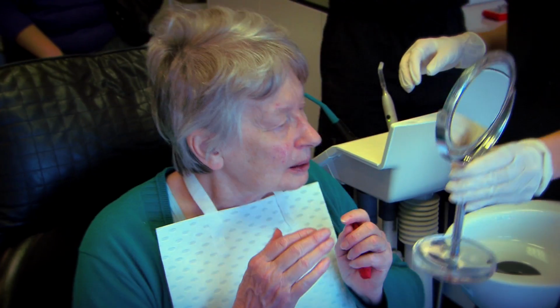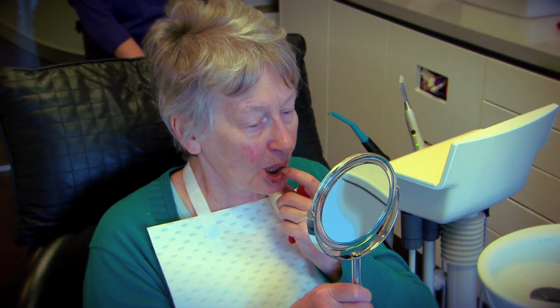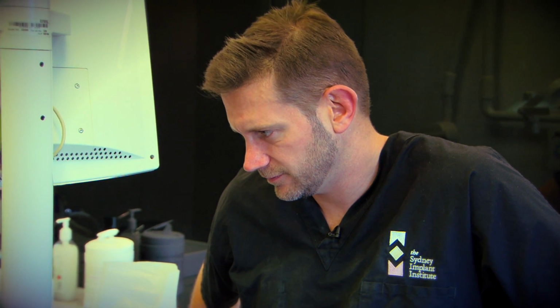Beautiful. I've got a very full mouth. You have. Bite down. Oh, and these look wonderful. Yeah. Bite down. They're good, aren't they? The reason you've got a full mouth, do you notice, can you see how you've got less creasing here as well? Because I've opened your bite up. Yeah, because your bite was definitely overclosed. Yeah. What do you think? Good. Yeah, it's good.